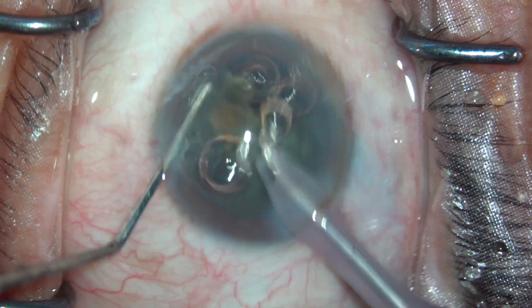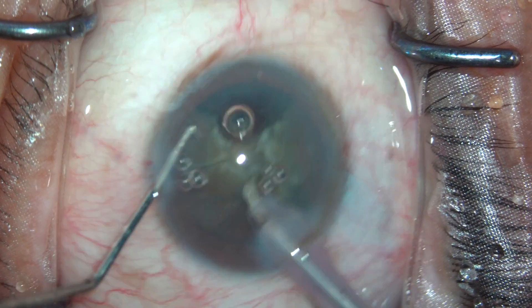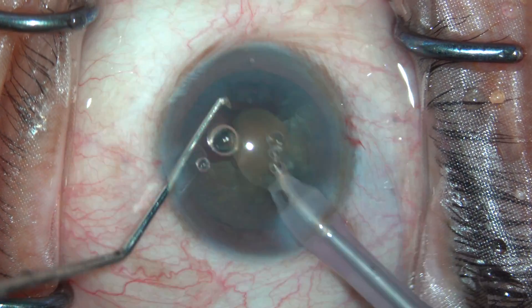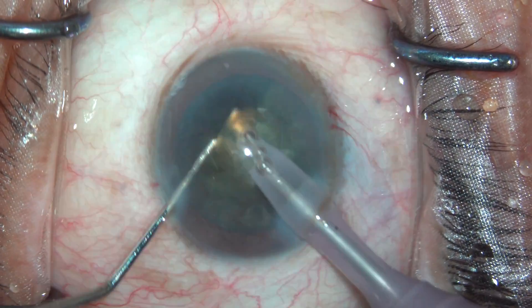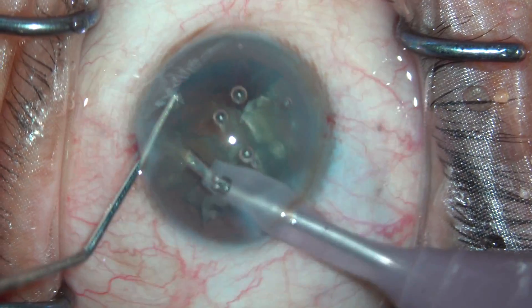I'm using a Laureate phacoemulsification machine from Alcon — I have no financial interests. The power is about 55 to 60 and the vacuum is about 360.